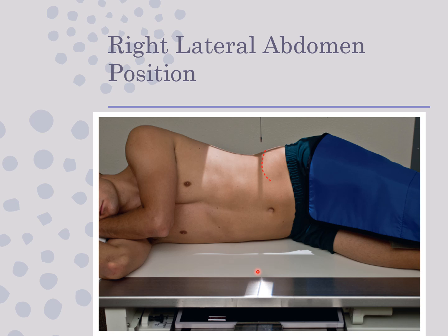I know it's a lot, but in both cases, the dorsal decube and this, gravity is going to pull everything down, but it's still going to be in the way of your image. It's not going to help like with upright. At least with upright, gravity pulls everything down. In a way, this one and the dorsal decube both are going to place the bulk of the anatomy in the path of the primary beam.